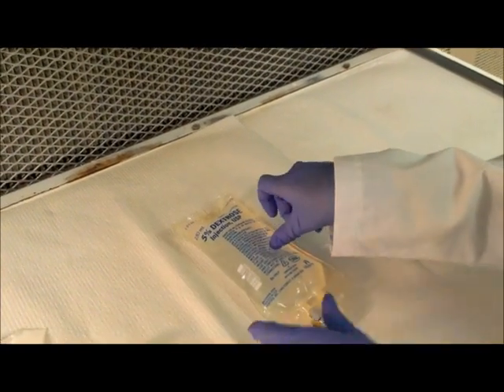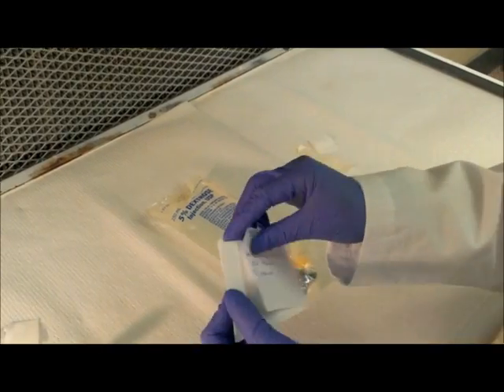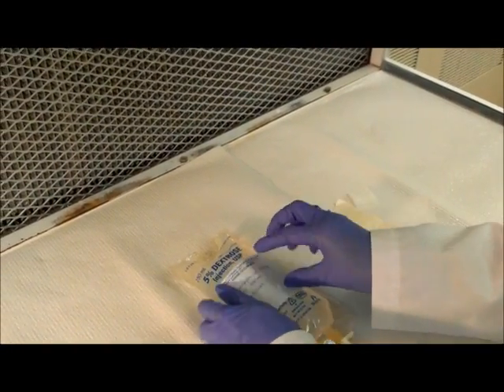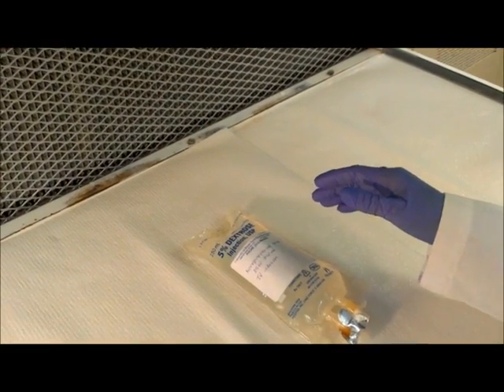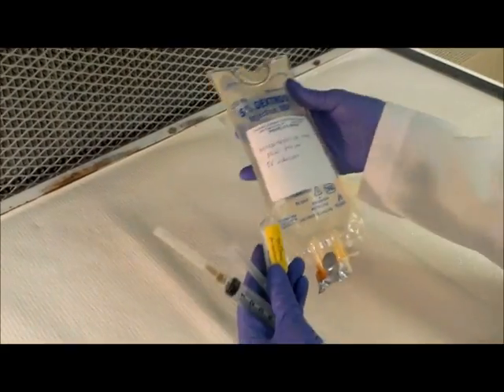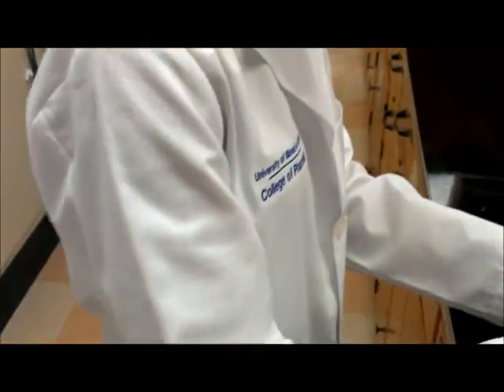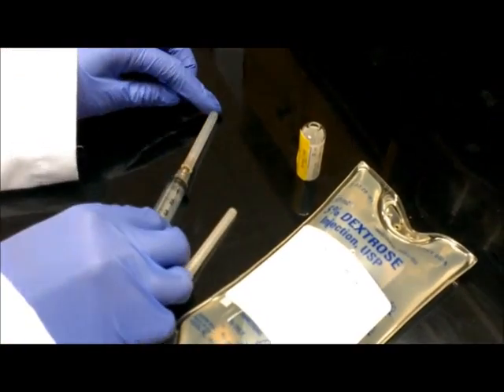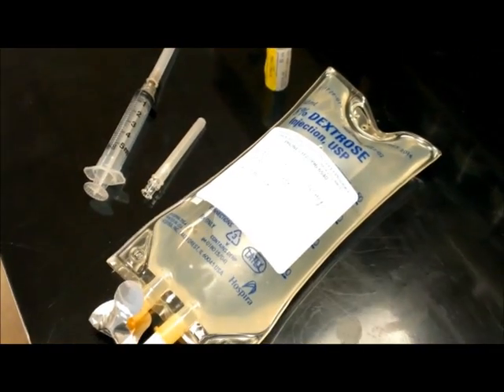Christine will now label the bag with the amount injected and place the preparation, ampule, filter needle, syringe, and needle for the pharmacist to check. And that is how you prepare an IV bag from an ampule.